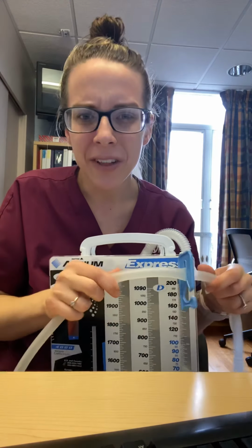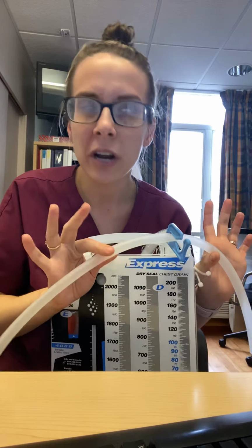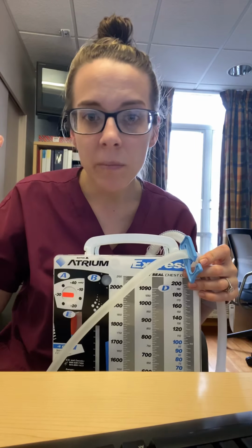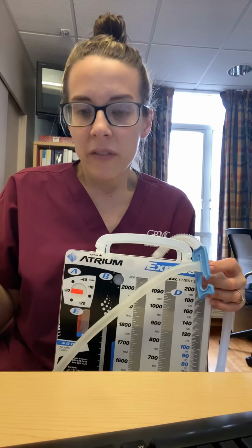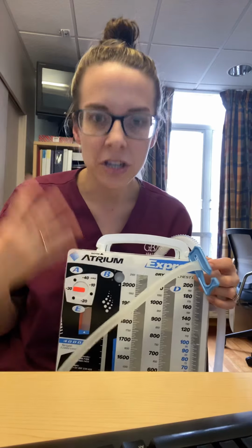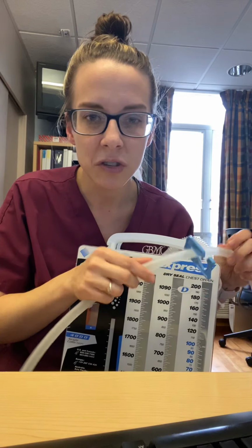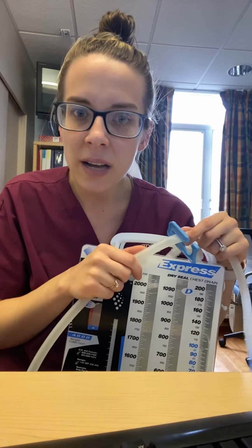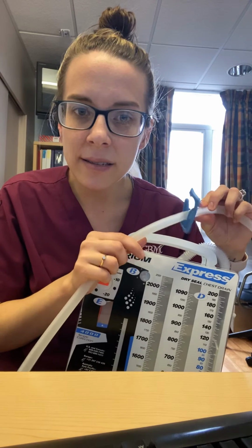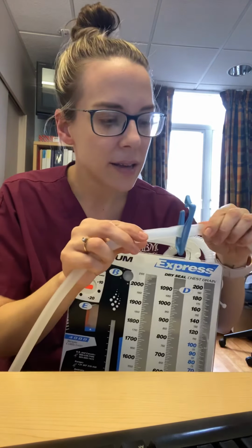So we would do this for, I don't know, every surgeon was different. Again, anywhere from 1 to 4 hours. We'd get a chest x-ray, and if the lungs stayed up, there was no evidence of a reaccumulation of a pneumothorax, then that was confirmation that we knew they were going to be okay and we'd remove the tube. I haven't seen clamping trials done at GBMC, but just in case you come across that, that is why that's there and how that works.